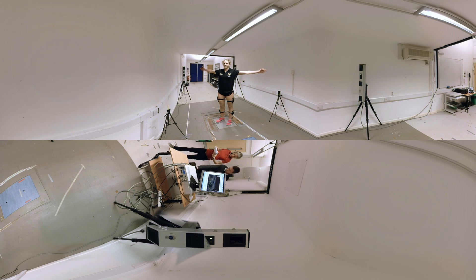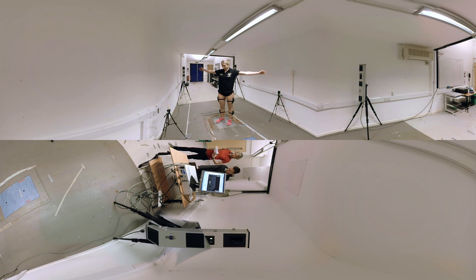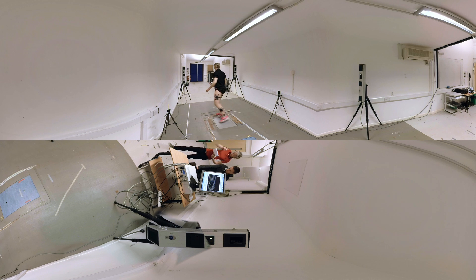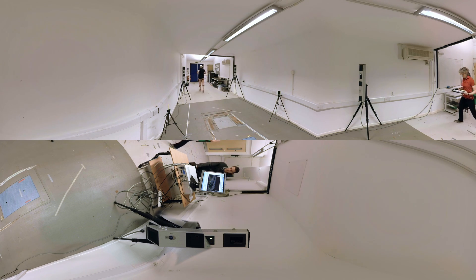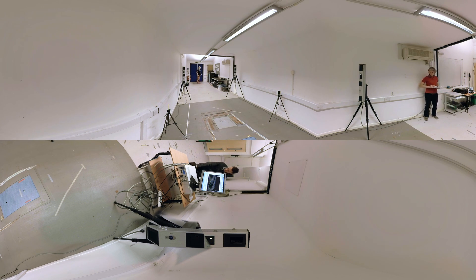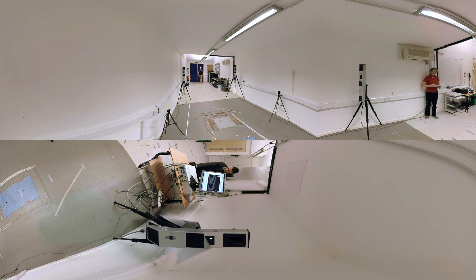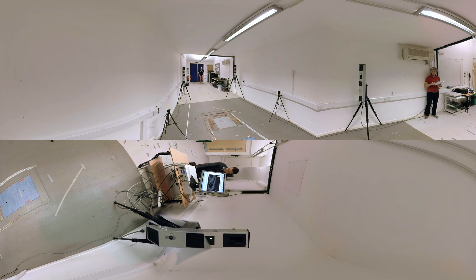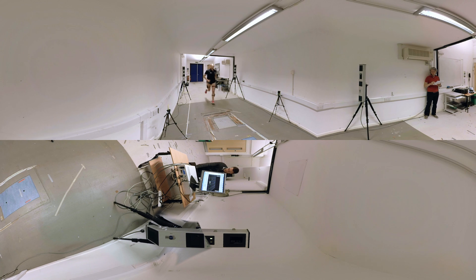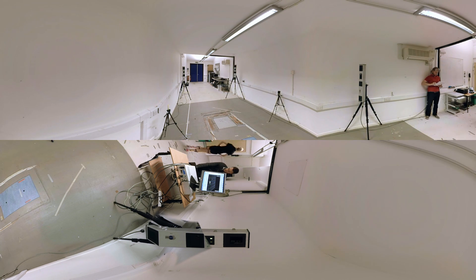In this gait laboratory, we are using our advanced motion capture system for a three-dimensional analysis of a participant during running. Markers are positioned on the legs of the runner, and additional virtual markers are also in place, which can only be seen by the motion capture system.